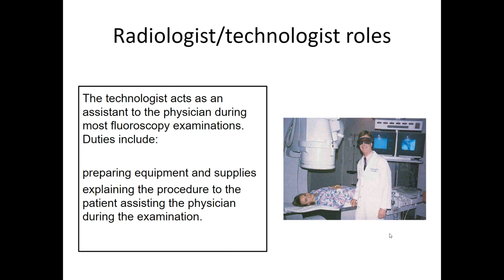And what is our role in fluoroscopy? It's basically to assist, right? To prepare the room, get the barium ready, and as you may have seen, there's different types of barium depending on the procedure. If it is a barium enema, then we may be responsible for inserting the barium tip. We don't do that under fluoroscopic guidance, by the way. We just aim and hope for the best.